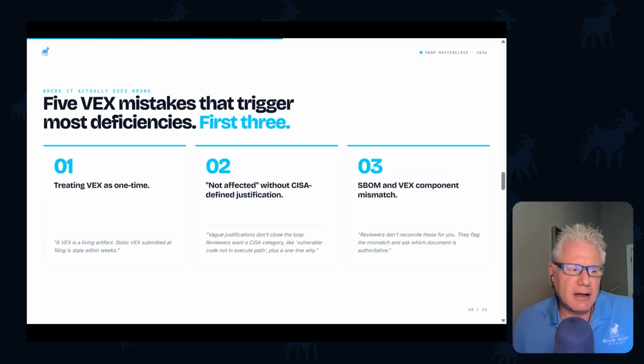For VEX in any vulnerability assessment, there's a couple or 5 really things that make deficiencies come up very often. One, and we kind of touched upon this a little bit, is vulnerability is not a point in time study. It needs to be continuous. So if you're looking at a component that makes up your SBOM, it may have a vulnerability today, tomorrow it may have a higher vulnerability. So we have to continuously assess for vulnerabilities. VEX is a living artifact, just like the SBOM. You may add software, so your SBOM may expand. But even if your SBOM is static, you don't update your software, vulnerabilities may exist. So you continuously have to evaluate them using VEX or any other tool for new vulnerabilities.